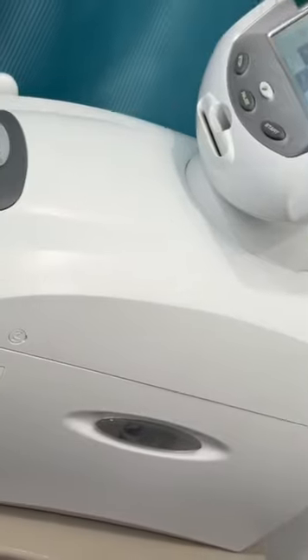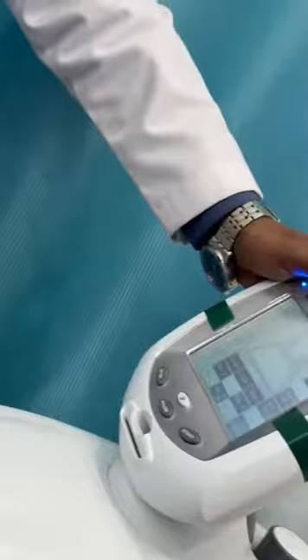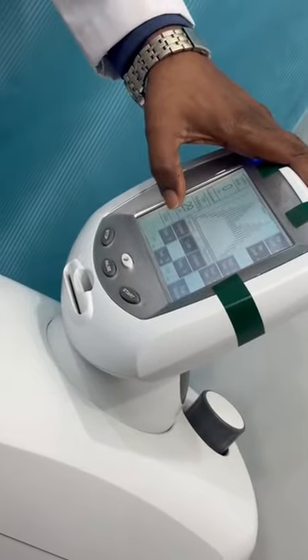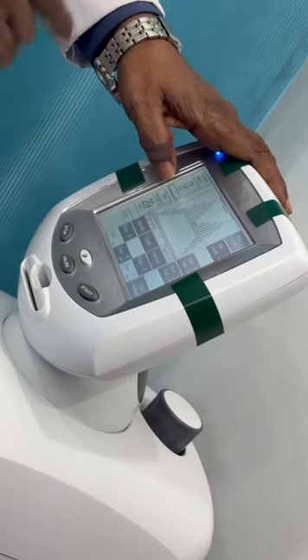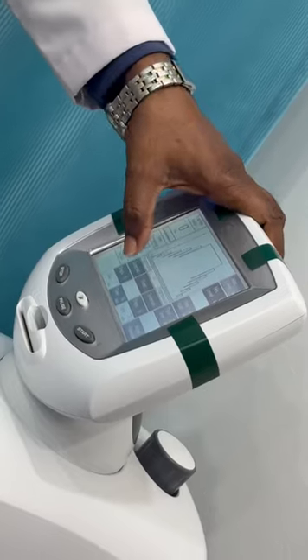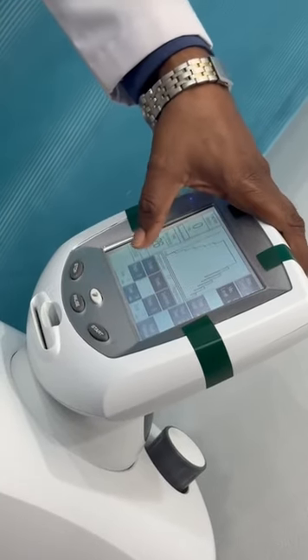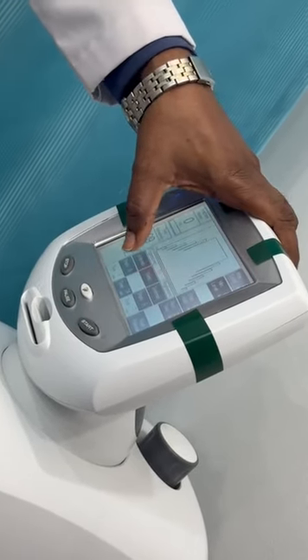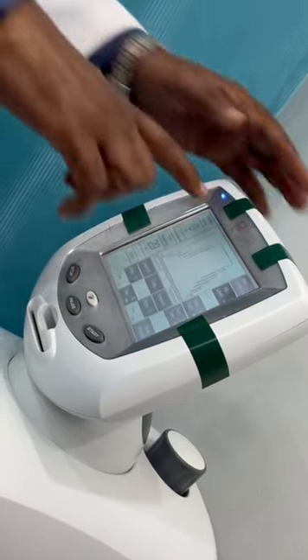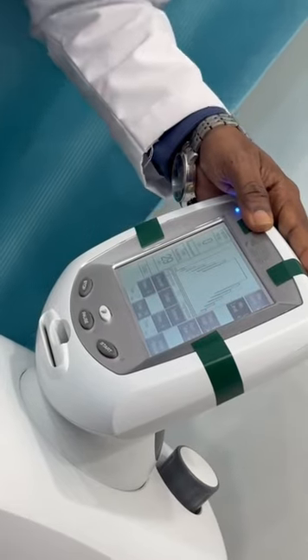If you keep this one here, okay, so the progression will be like intermittent. It will put a static hold. According to the graphical representation, it keeps on progressing, then it comes down. So I'm keeping static, mostly static, and intermittent will keep. In this particular stage it will continuously keep on pulling.